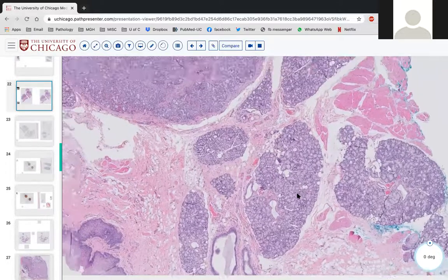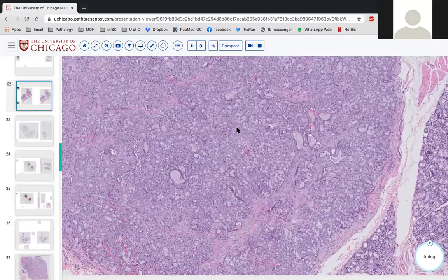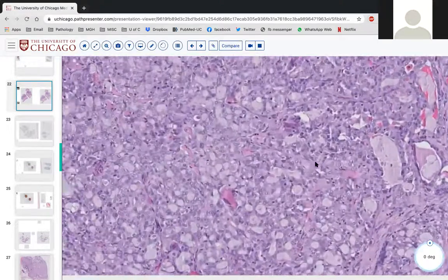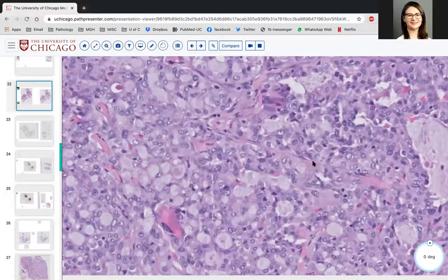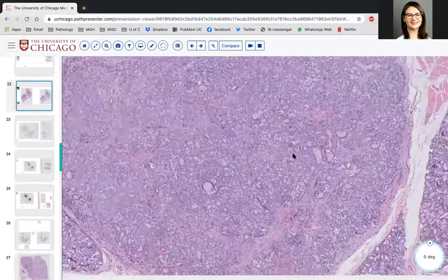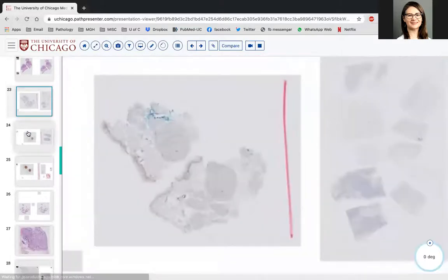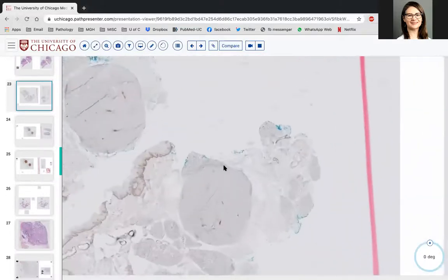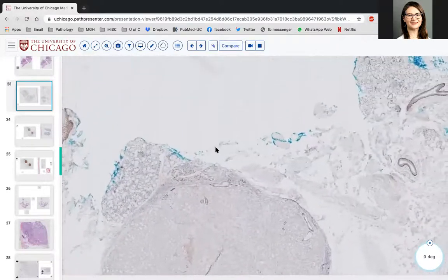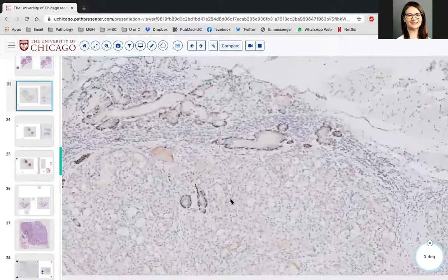I've also seen mucoepidermoid carcinomas that are a little bit cystic present as mucoceles of the upper or lower lip. So definitely things to take into mind. And in this case, it's so well circumscribed on low power. But I think that P40 really highlighted the fact that it entrapped some of those peripheral ductules, right? So this is truly an invasive carcinoma, even though it appears quite circumscribed, and it warrants the diagnosis of a low-grade carcinoma.